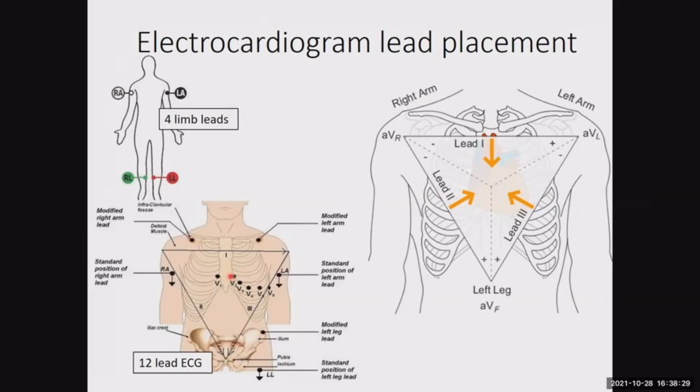Even though we're using a 12-lead ECG in a clinical setting, they're basically comparing 3 leads at a time, measuring changes in the voltage differential and the direction of those voltage changes in relationship to the body.